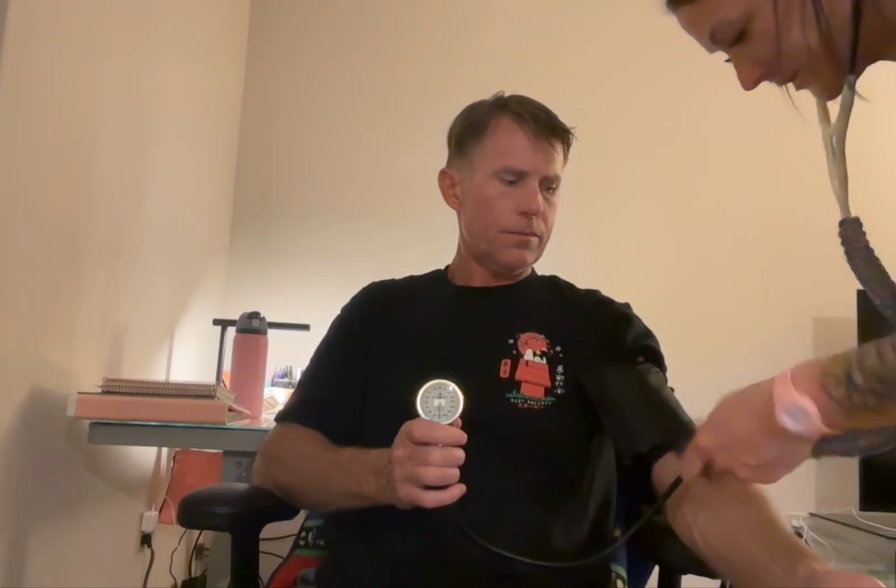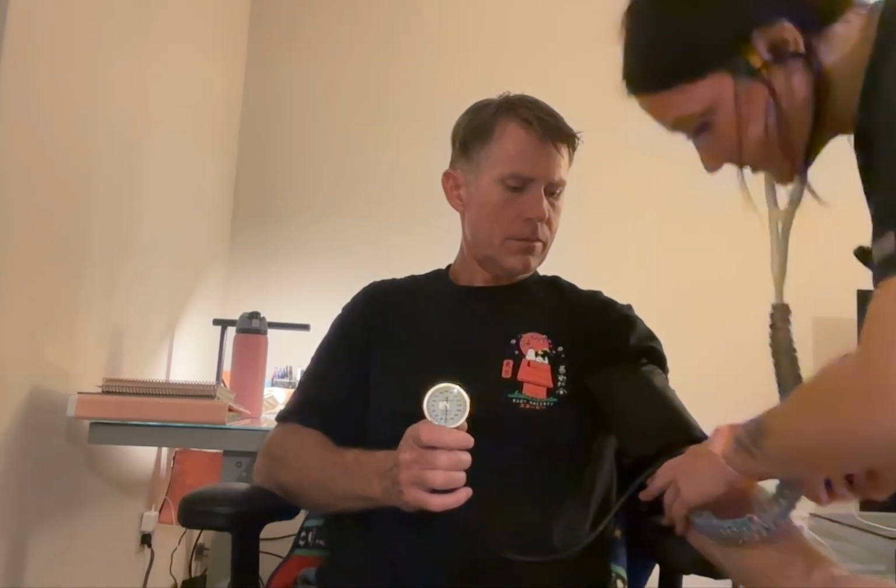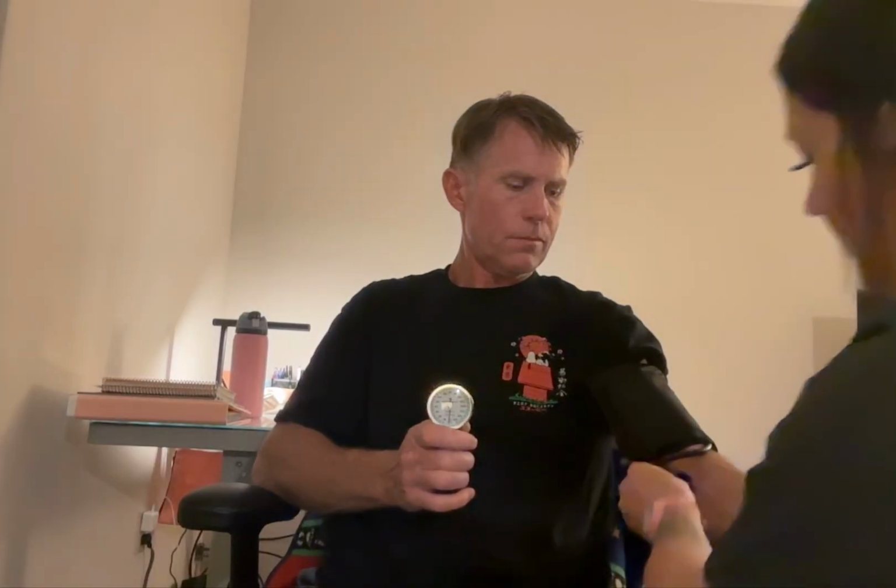And then I'm going to let it deflate 1 to 2 millimeters per second. As I deflate it, the first beat that I hear is going to be the systolic, and then the last beat that I hear is going to be the diastolic. I'm going to scoot in a little bit closer so you can see it. And I'm going to make sure that the bell of the stethoscope doesn't touch the blood pressure cuff. I'm going to take a peek at it if you don't mind.